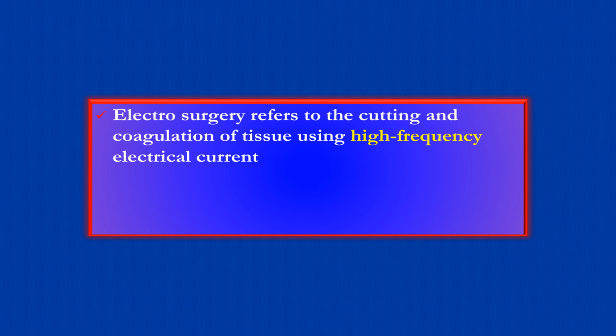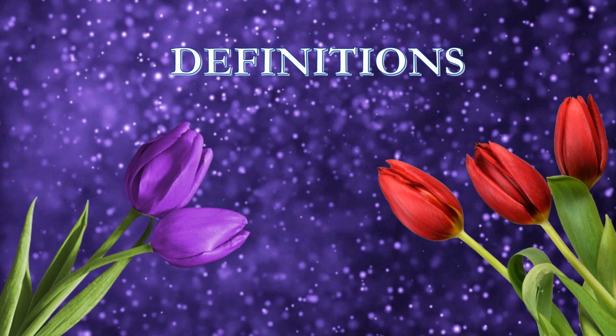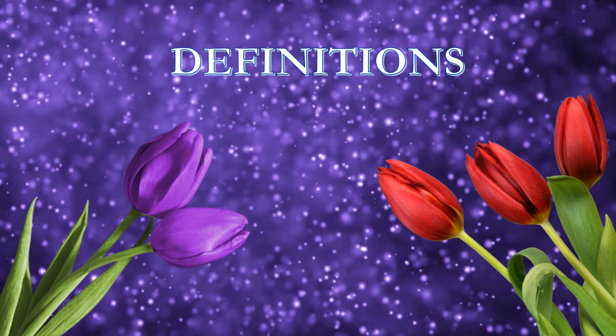What is the difference between electrocautery and electrosurgery? Is it the same? Of course, no. Electrocautery is the passive application of heat to the tissue to produce the effect, while electrosurgery refers to the cutting and coagulation of tissue using high frequency electrical current. Remember, high frequency electrical current. Definitions.